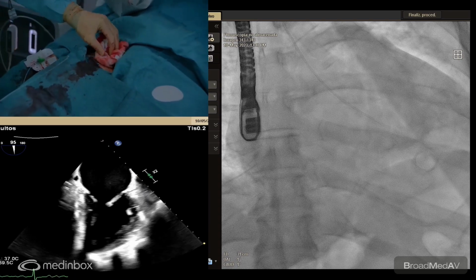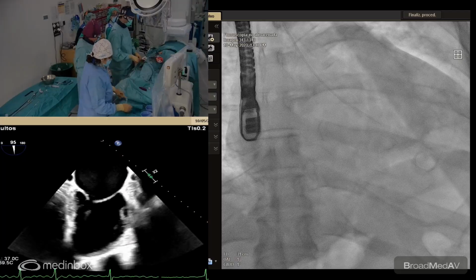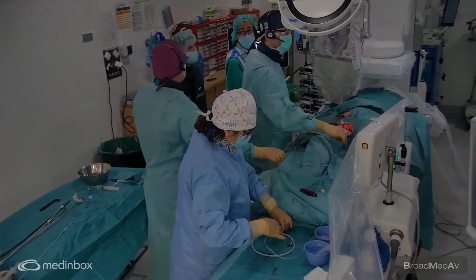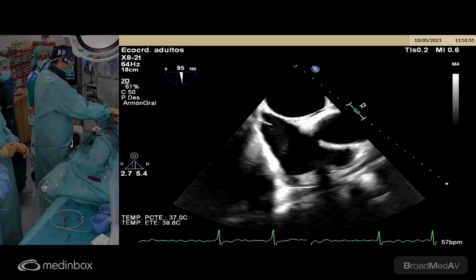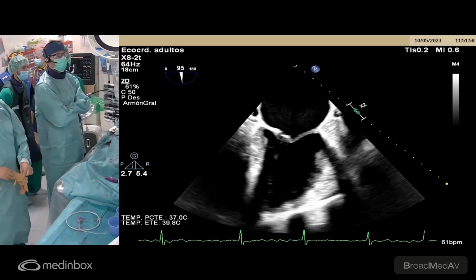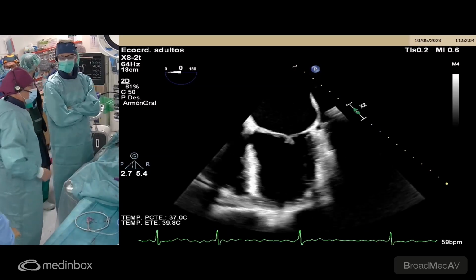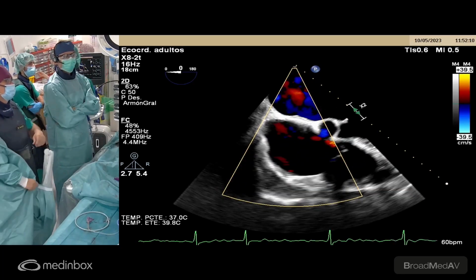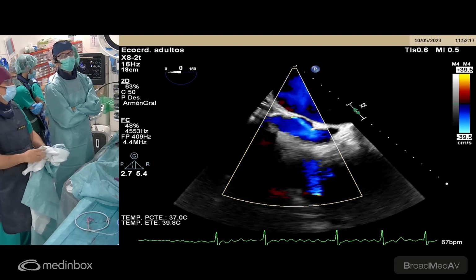Any other comments, Silvia, Jesus, just before? No, the result is very good, to be honest, and well, it's a bit annoying because if you look at the calcium, the case was so. There were some concerns about the medial calcium, but the result is excellent. However, there's some degree of unexpected results that you cannot predict with the image. Yes, this kind of case is quite unpredictable, but I think this case is very educational. It's not a very common procedure, and I think we have spoken about a lot of things regarding this mitral valvuloplasty. So thank you all, the team.